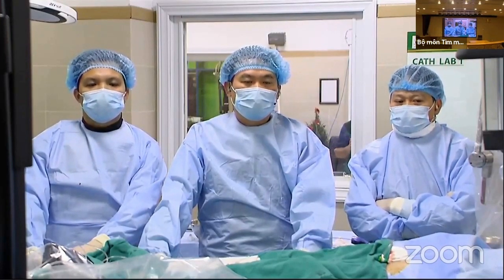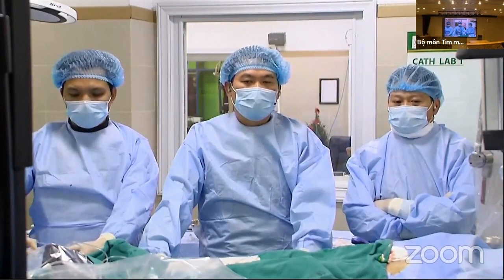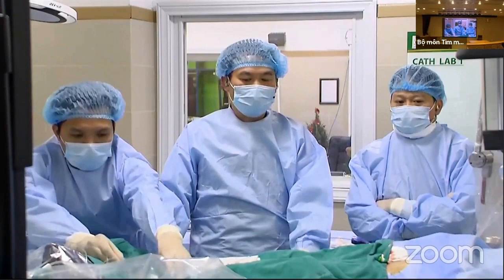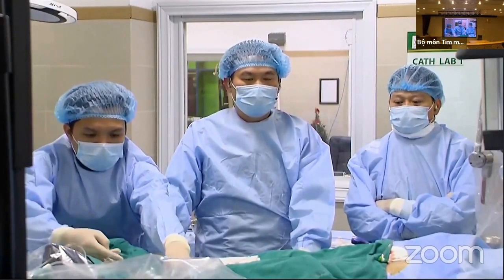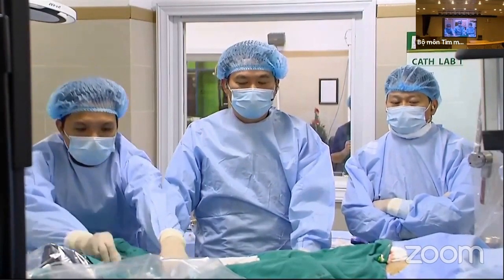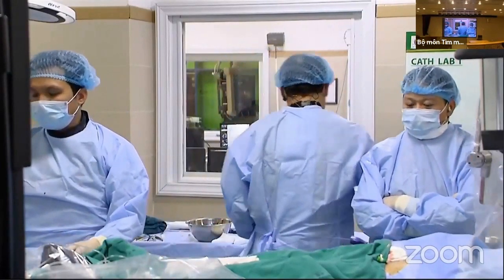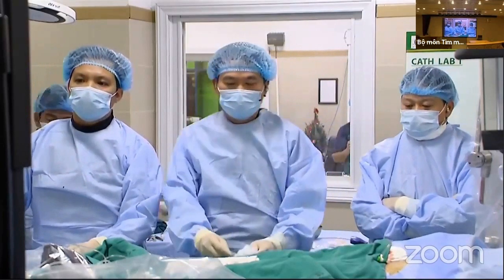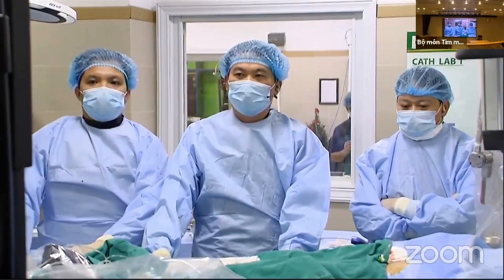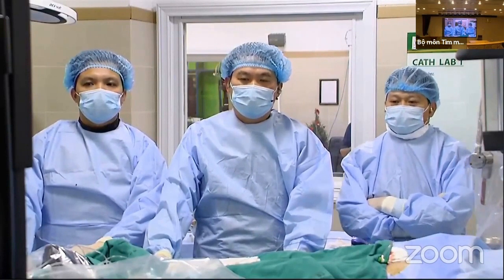So in this case, the dissection goes all the way down into the visceral vessels. So that's going to be challenging, how far down you're going to stent. If you leave that distal end in the descending thoracic aorta, it will probably cause you a problem later on, and you have to extend it down. So may I clarify your opinion, basically you will cover the whole part of the thoracic aorta, or you just cover the first part of the aorta? You would have to cover all the way down to the abdominal part of the aorta, at least down to the celiac axis. So what about your opinion, Dr. Saipul?